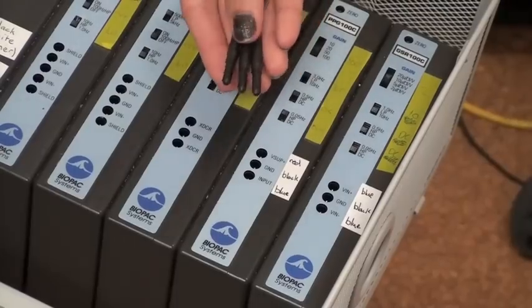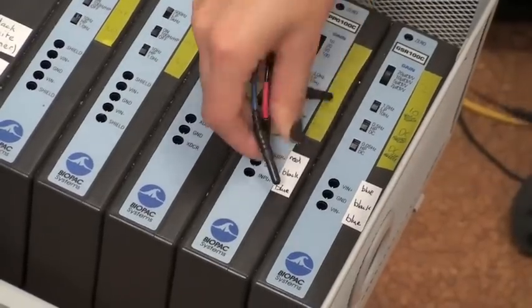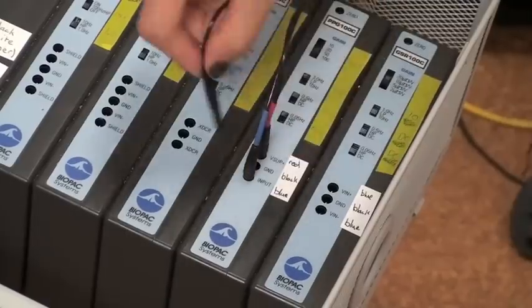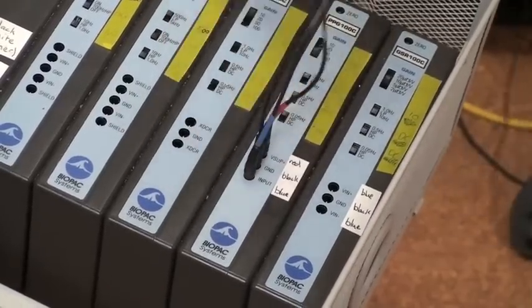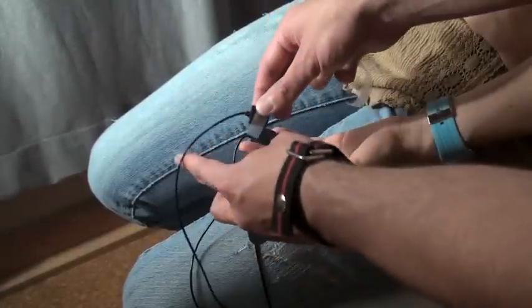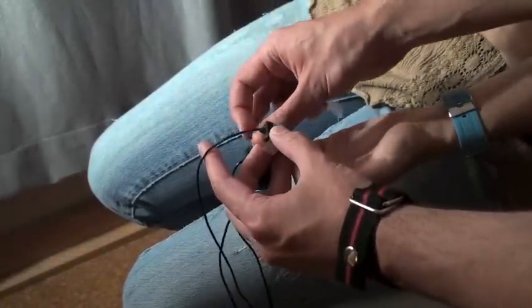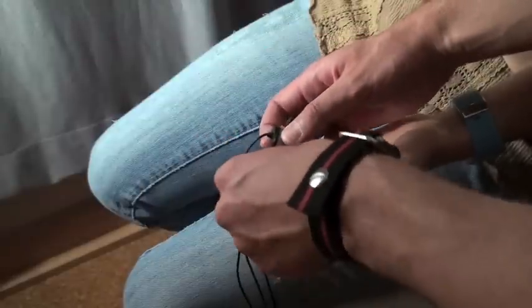The PPG sensor should attach to channel 4. Plug the red cord into the top outlet, the black cord into the middle outlet, and the blue cord into the bottom outlet. Wrap the electrode around the participant's middle finger — it should be snug but not too tight — and be sure to ask if the participant is comfortable.